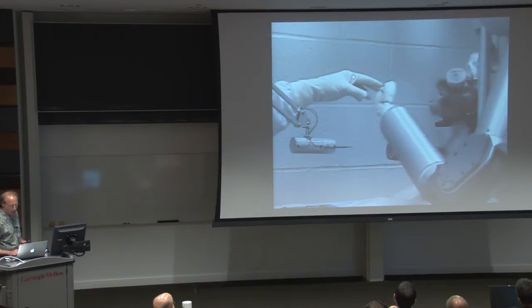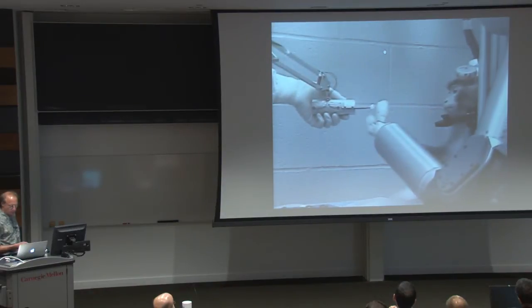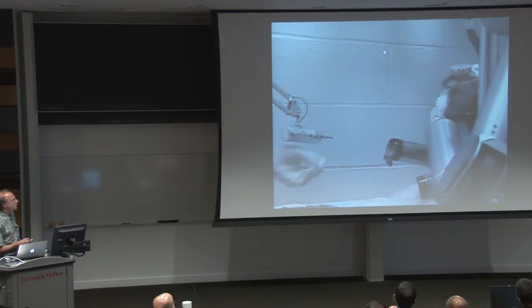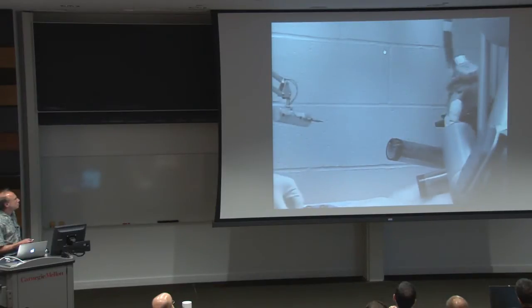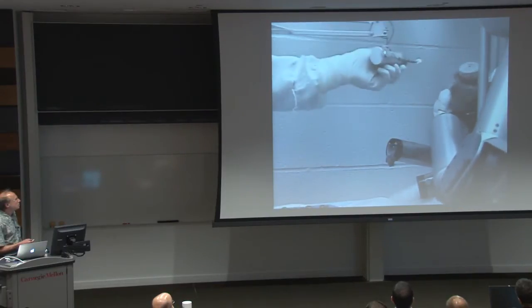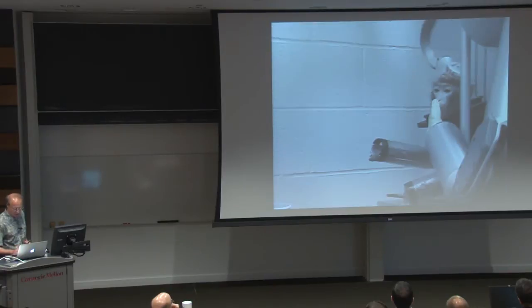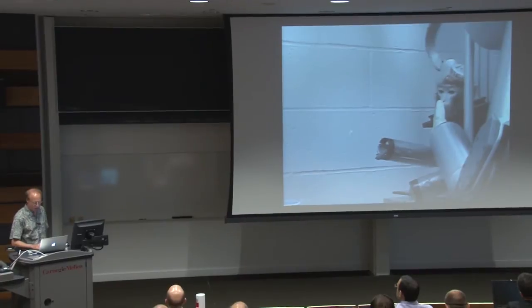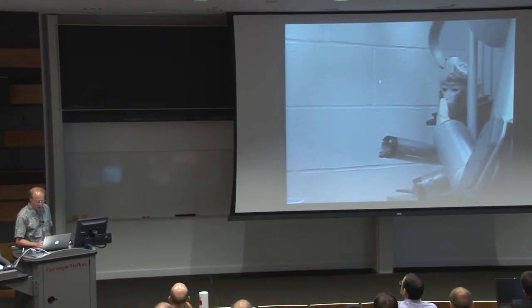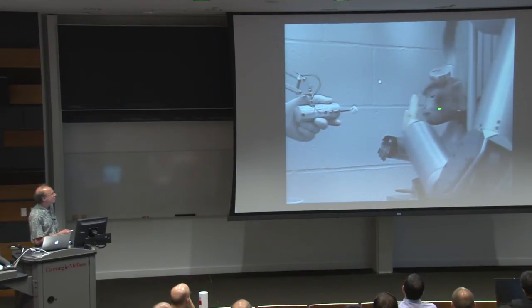So this was reported in 2008. So he's going for marshmallows here. Yeah, I'm sure a lot of you will recognize this as a Barrett arm. So he can reach anywhere in the space in front of him and get this. Now, this is, again, continuous control. Even while he's chewing, he's controlling the arm. There's no assistance of any kind. It's purely his brain signal controlling it. And to give you the idea, now he's got some marshmallow residue left on that, and he decides instead of going for the new one, he just wants to lick it off.